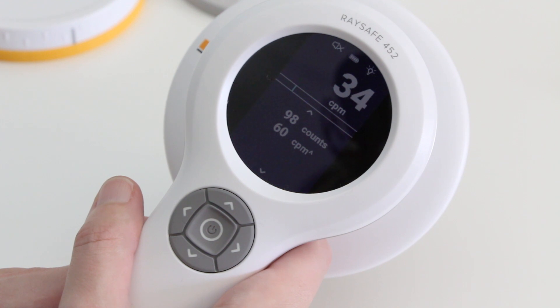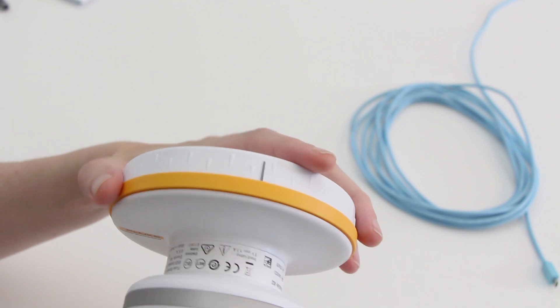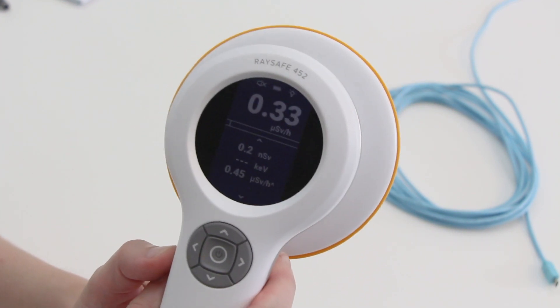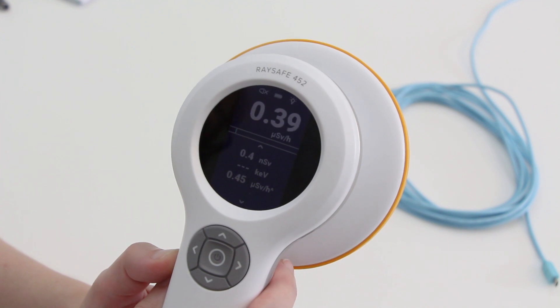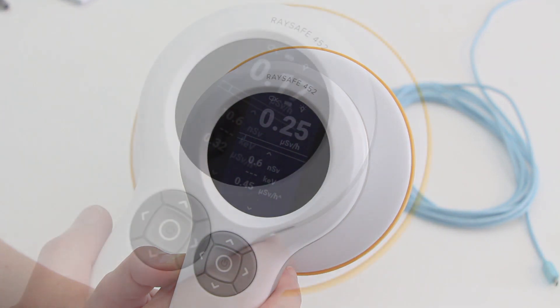Now let's put on the ambient lid. There is a marking on the lid for guidance — put the lid on and turn to lock. As you can see, the lid changes the quantity and the measurement unit. Now we measure ambient dose equivalent in Sievert.